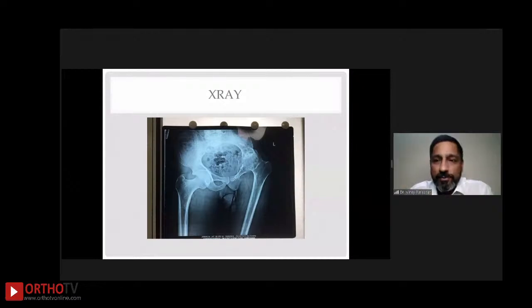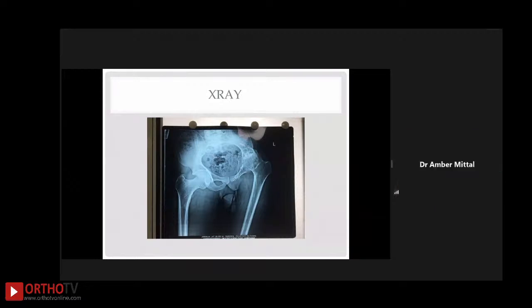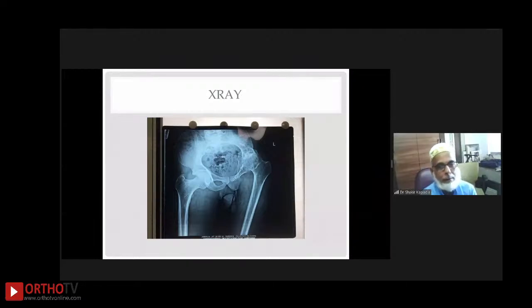I think Kapadia sir, you should take the lead and guide us. It looks quite horrible, but it will give you a good result, I'm sure. Because the lateral side is open, it is easier to handle. When you have an abduction deformity, sometimes there is a lot of crowding. But with an adduction deformity, when you are operating, I don't know which approach you are using, but I'm sure it would be easier to approach posteriorly.